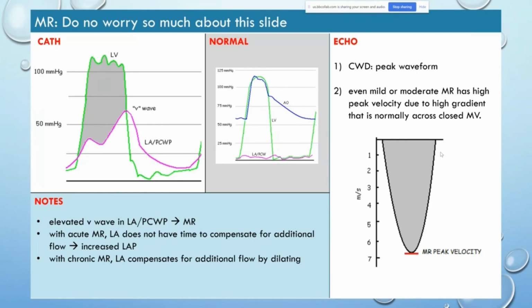So the pulmonary capillary wedge pressure, let's start with that. It gives the doctors an indirect estimate of left atrial pressure. That's why it's important. So what they do is they're going to use a catheter and move it all the way to the main pulmonary artery, and there'll be a balloon attached to that catheter.